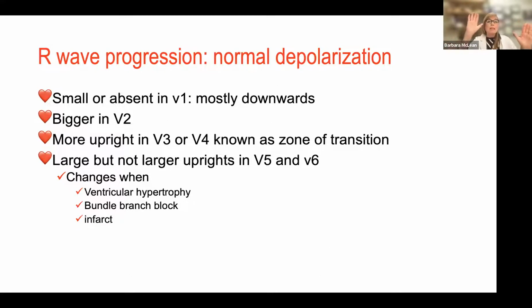So I've encompassed my heart with the V1 lead for the right and the V6 lead for the left. And we remember that when we're doing an EKG, we're looking at one impulse from two angles. So I always say it's like $1 million. That $1 million is always going towards V6. So the picture in V1 is going to be downwards. I'm so sad. The $1 million, the million vectors, the million currents, they're going away from V1.